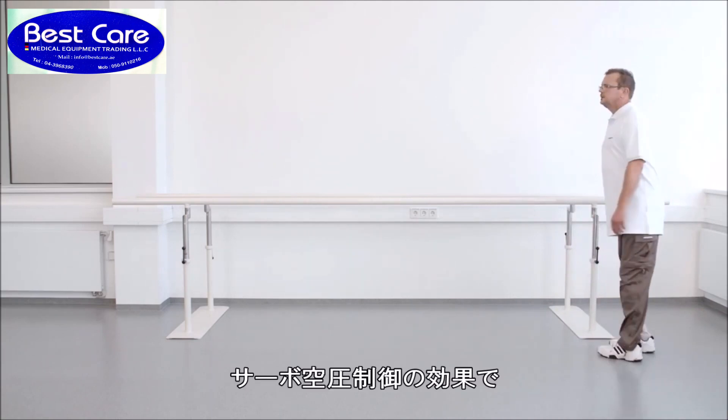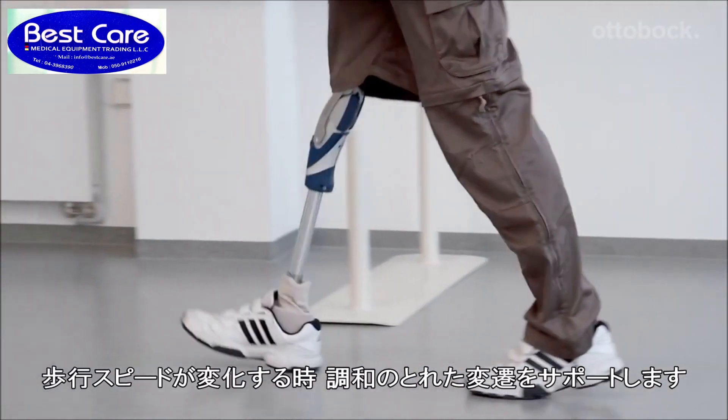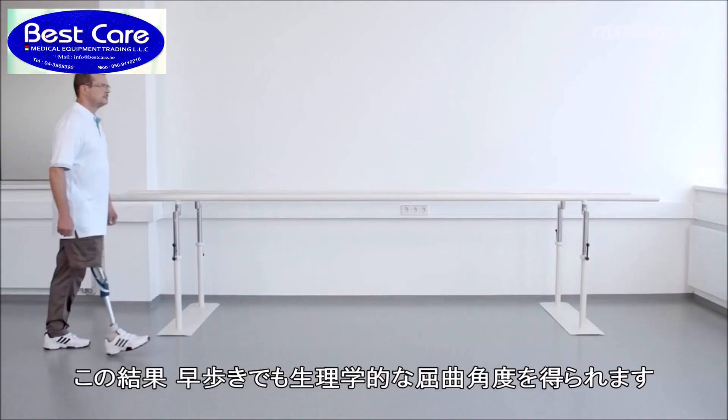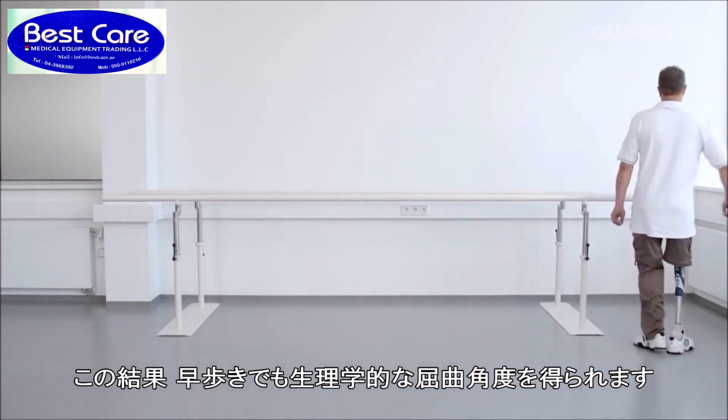Thanks to its servo pneumatic control, the 3R 106 Pro supports a harmonious transition from one walking speed to another, resulting in a physiological knee flexion angle during walking with higher walking speeds.